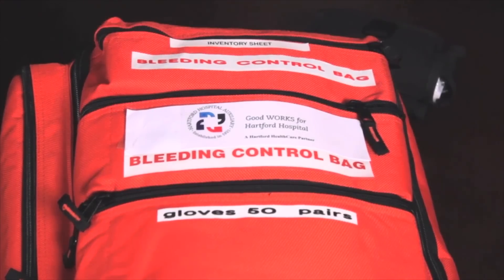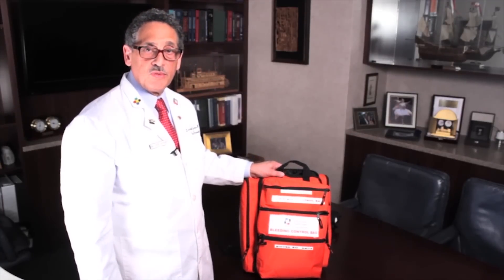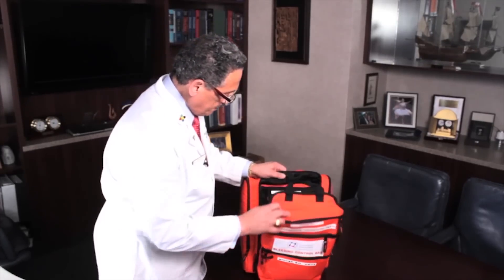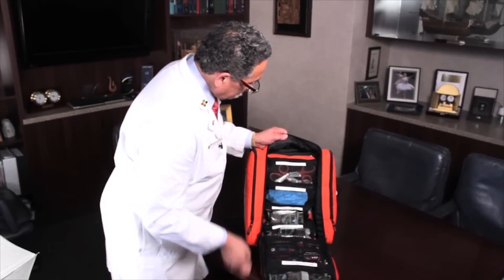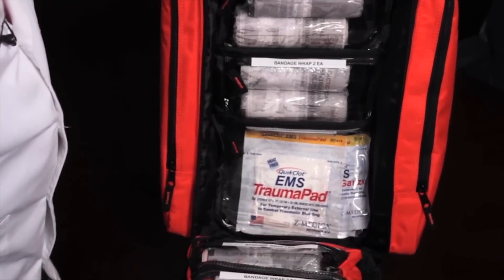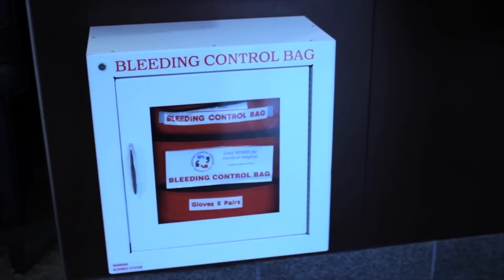This is a bleeding control bag. The bag can take care of about 20 people who have severe bleeding. It has shears, gloves, tourniquets, and hemostatic dressings. Look for these red bleeding control bags in a white box in public places.